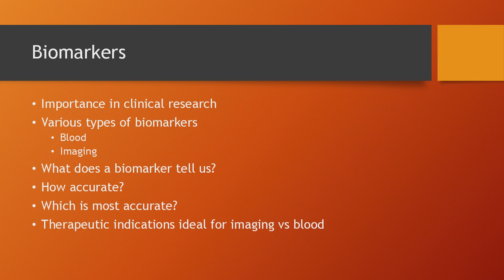In this case, the biomarker would be diagnostic, right? Because it would tell us that there is an atrophy in the hippocampus. But we can have also prognostic biomarkers. For example, we are now working in rectal cancer imaging biomarkers, and we have identified already some imaging biomarkers of the heterogeneity properties of the tumor that are telling us what patients will relapse.